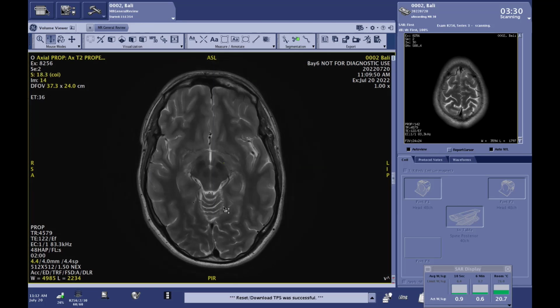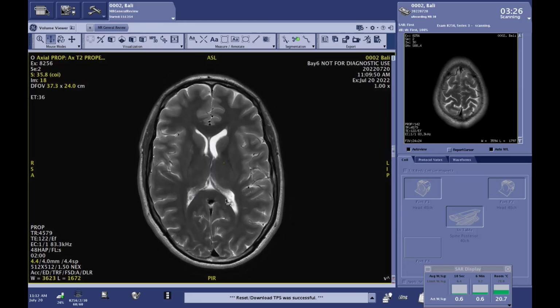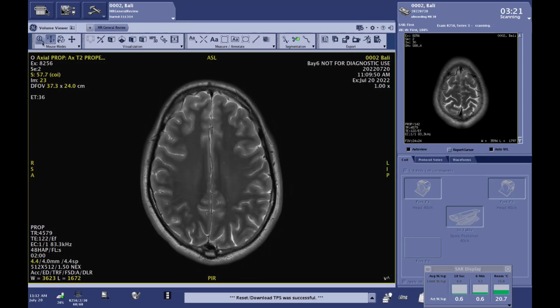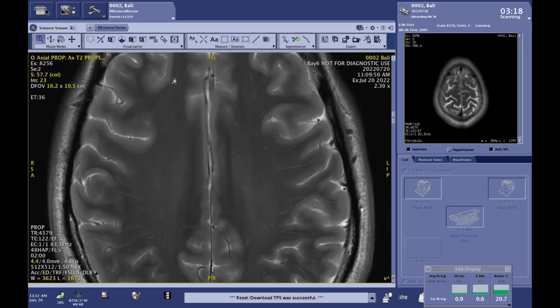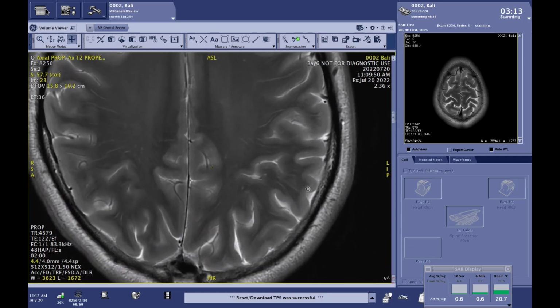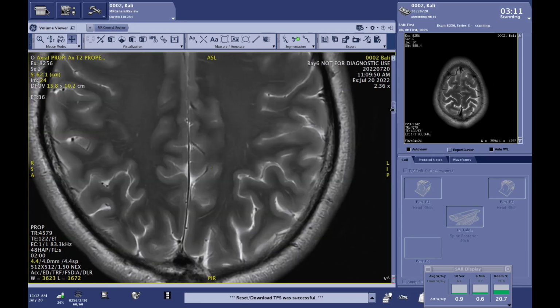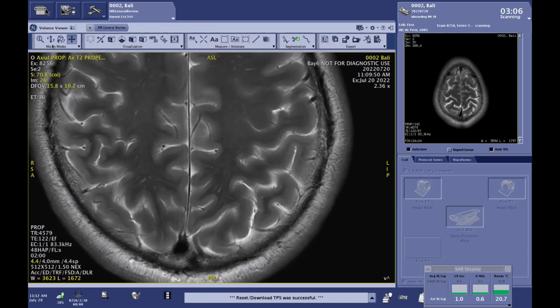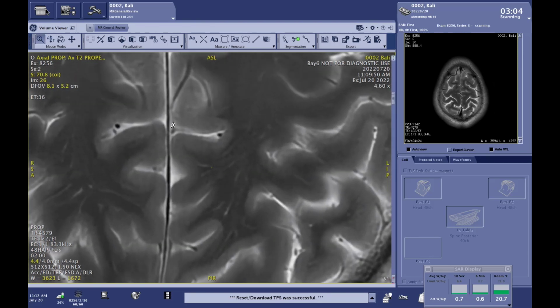Even if the patient would move slightly, we wouldn't worry about that because Propeller is helping me with the motion correction here. And maybe that is really now the interesting part, that we can zoom in that high because we have such a high-res image. Yes, with the Recon DL, right? We can look into all the details here, and since it was truly acquired with 512, I can zoom in as much as I want. I'm not scared that I break the resolution at any point.